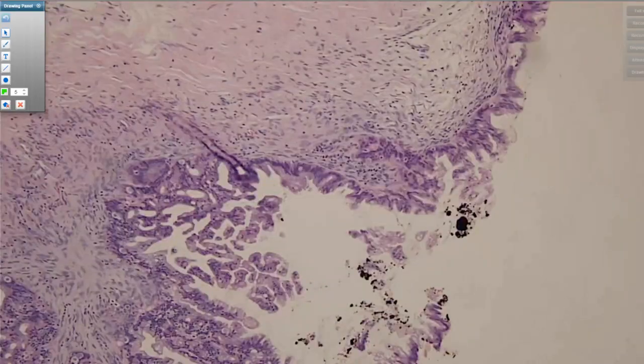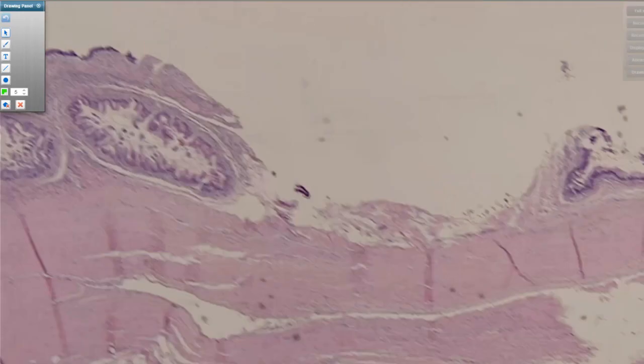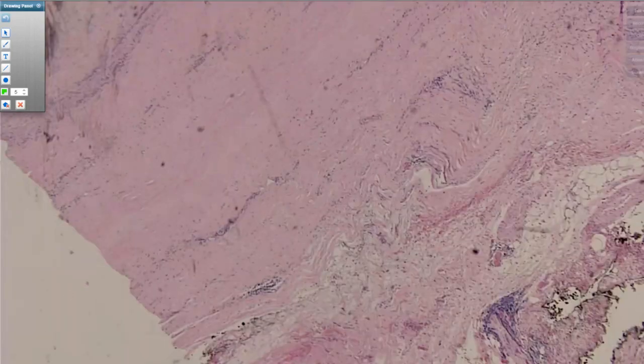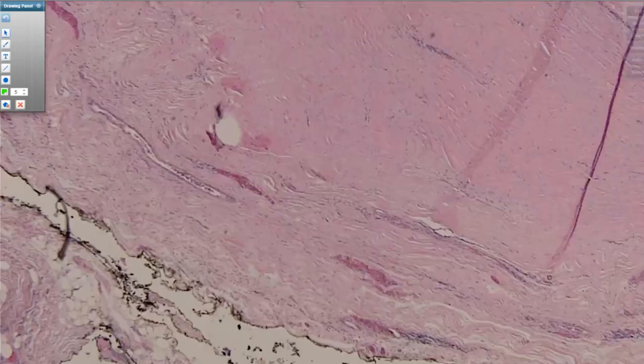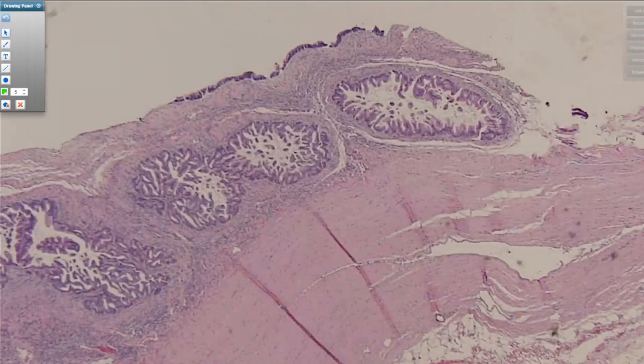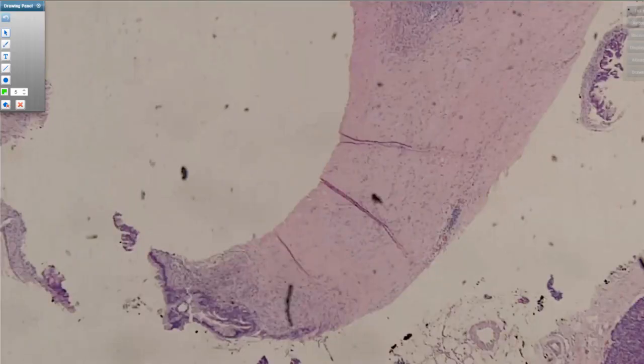But this issue of budding and having entrapped ducts within the cyst wall is really common with MCNs because they've gotten so hyalinized and fibrotic because of all the degeneration. It entraps both budding from the cyst itself as well as normal, just atrophic looking ductal epithelium from the pancreas.